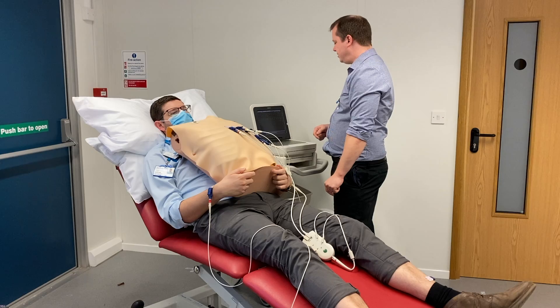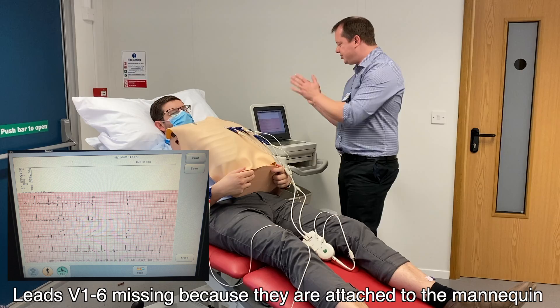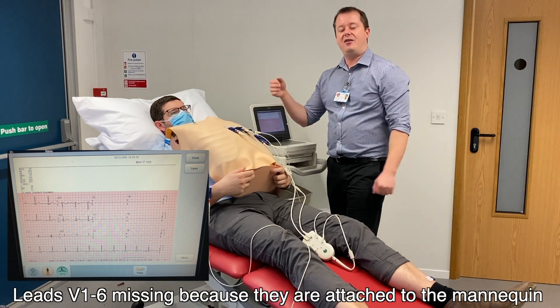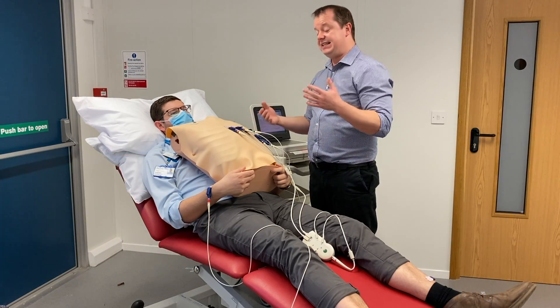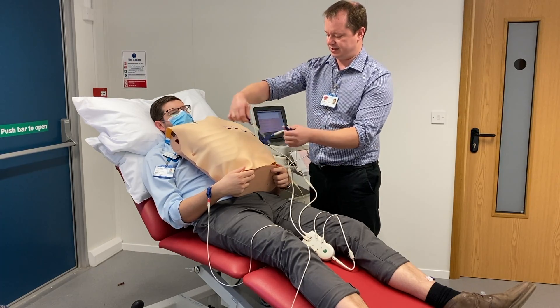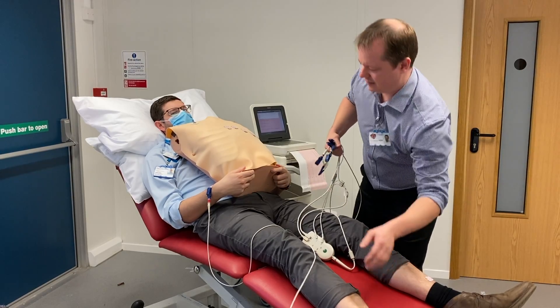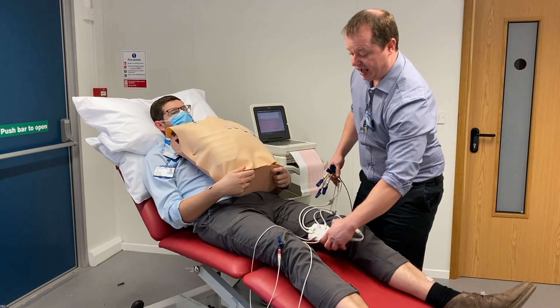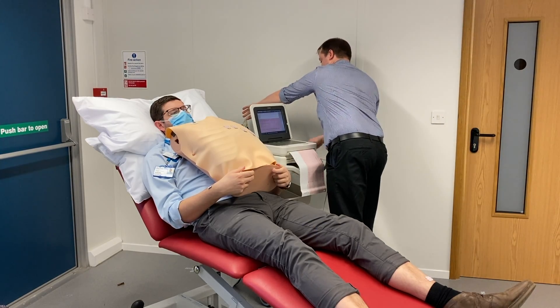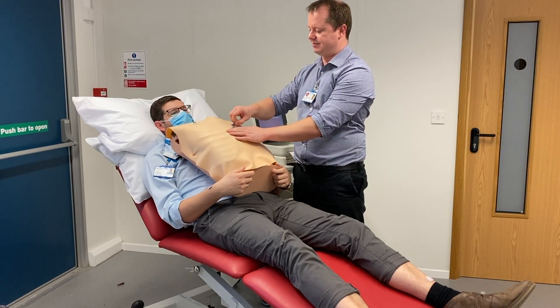We press print and wait for it to come up on the screen. Once we check it and make sure it's okay, we can then print it off and it will send it to eCare. Once we've got that, we can detach the patient from the ECG machine - we just pinch each wire and take them off. You can ask the patient to remove their own sticky tabs, but they might not get them all, so it's probably a good idea to help them.